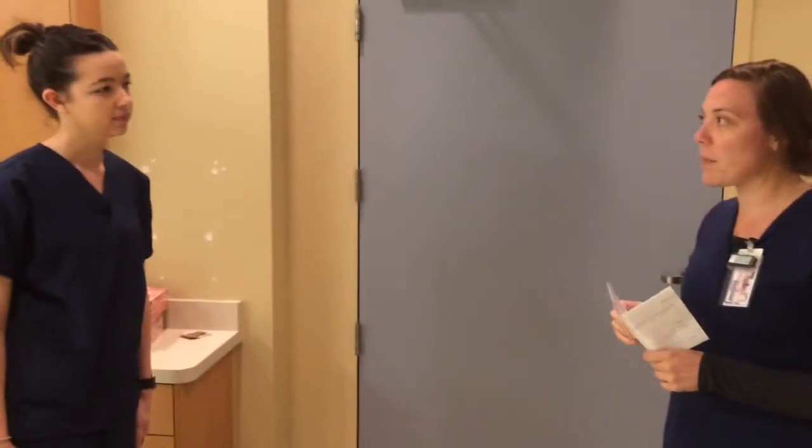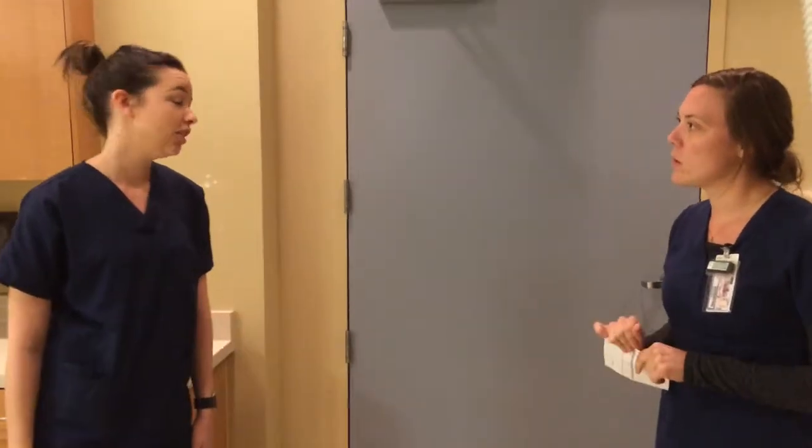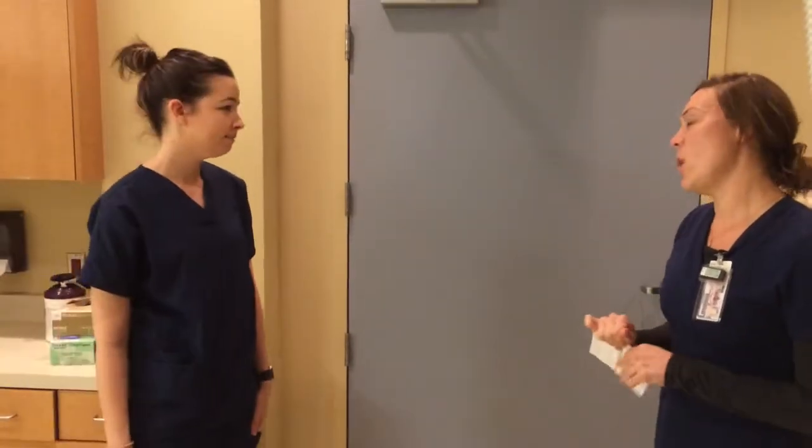All right. Is there any possibility of pregnancy? No. Okay. So what brings you in today? I had a cheerleading accident and I fell on my head. Oh, okay. So we're going to be doing some pictures of your skull today. What we're going to have you do is you can stay in your outfit. You don't have to change.